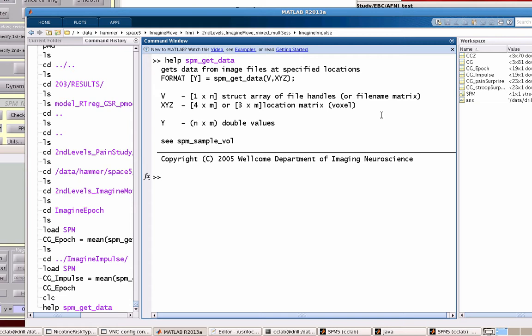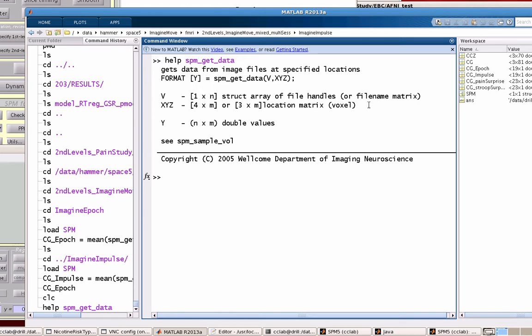This is the same thing that happens when you use the ROI defaults in the Marsbar graphical user interface. The second argument is XYZ, simply a matrix that contains the information for where each coordinate is in each of these ROIs. We already have those - we have CG and CCZ.